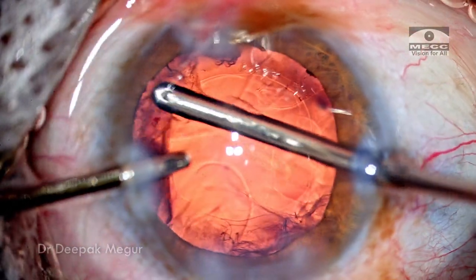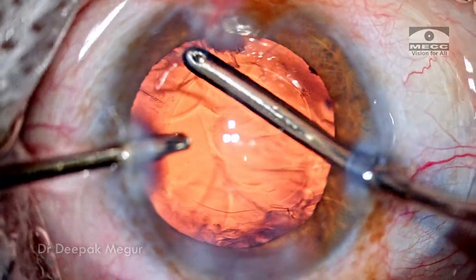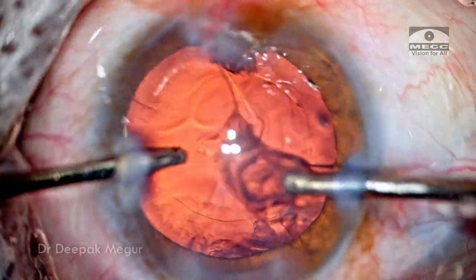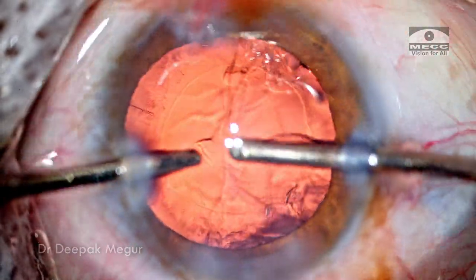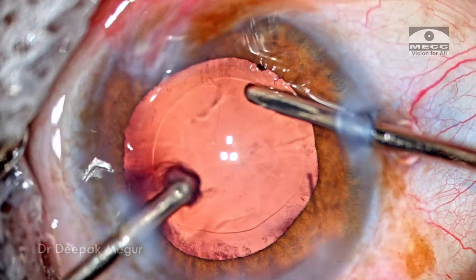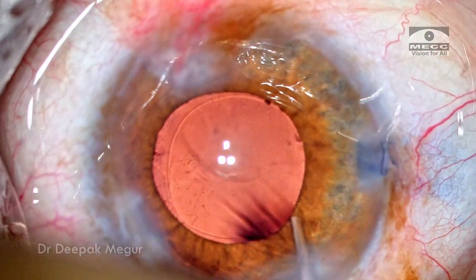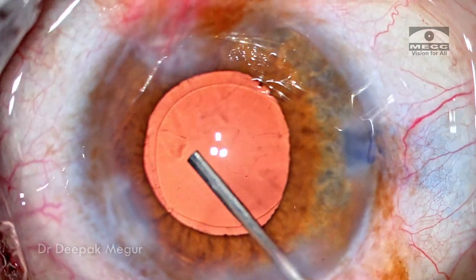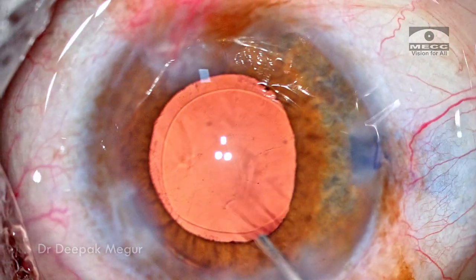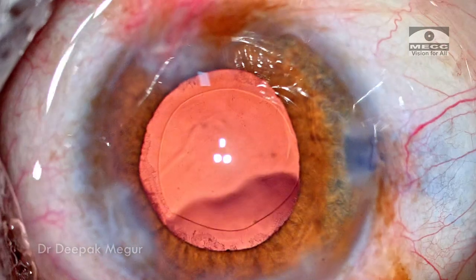The pupil is very well dilated and the visualization is great, so cortex aspiration is not difficult at all. It's a pleasure to aspirate the cortex when we can see things so clearly. The posterior capsule has certain lens fibers attached to it — I'm going in to polish the posterior capsule using the I&A. It takes about a minute or so to clean up the posterior capsule, and now it is time to put in the lens.